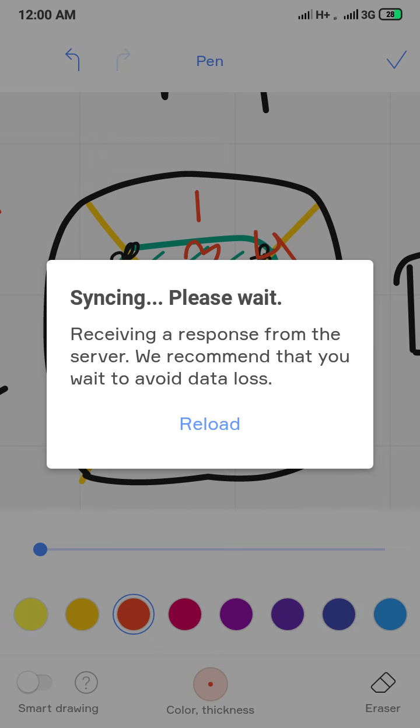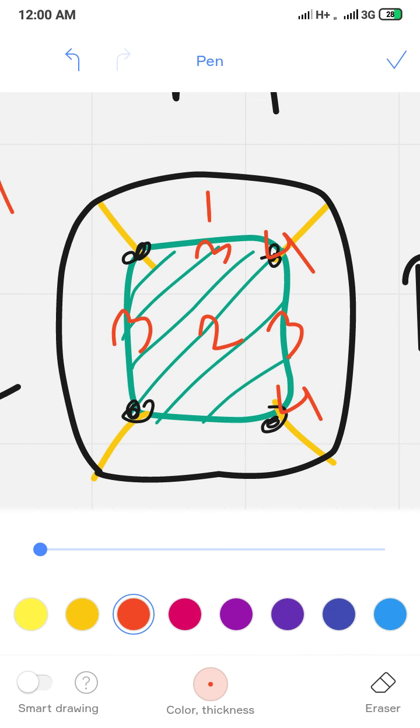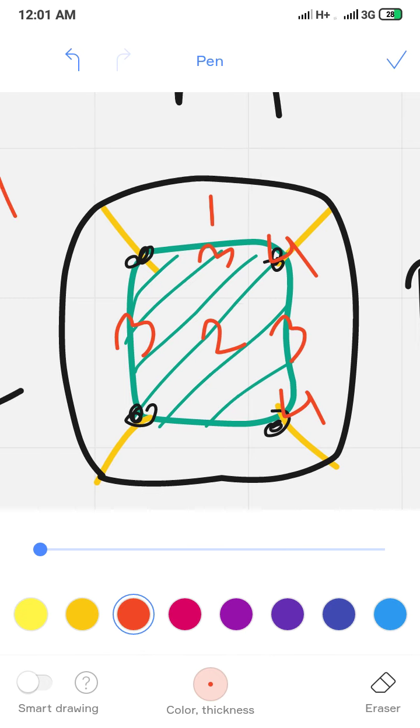then you can go look for minor canals, and minor canals can really have their orifices anywhere, but you will go as the rule of probability. They will probably be located in number 3 or number 2 positions.